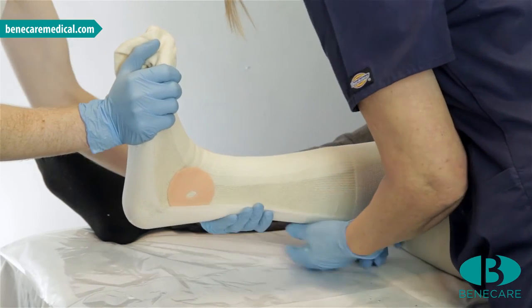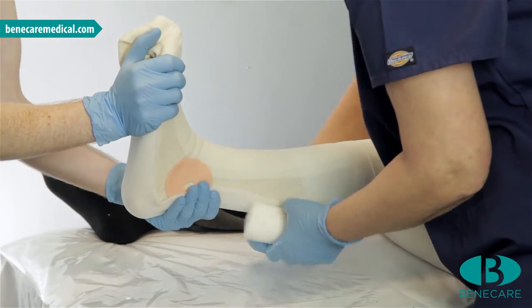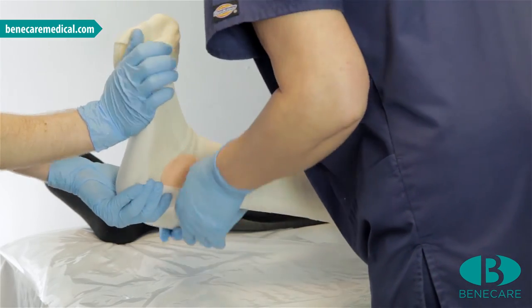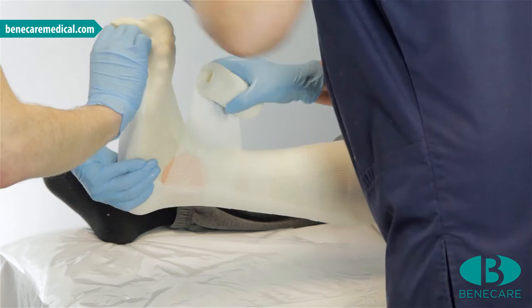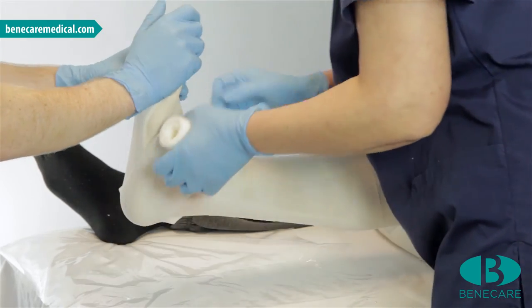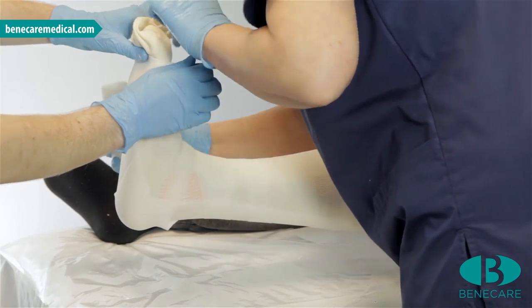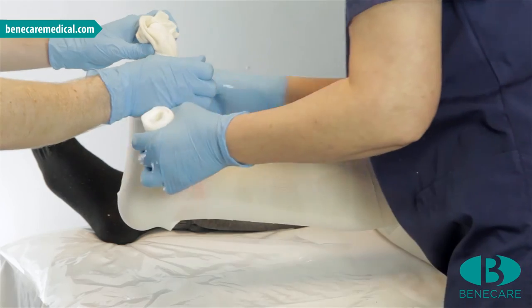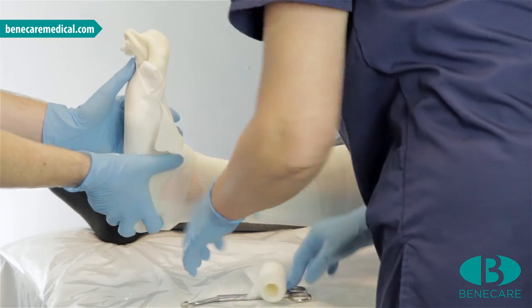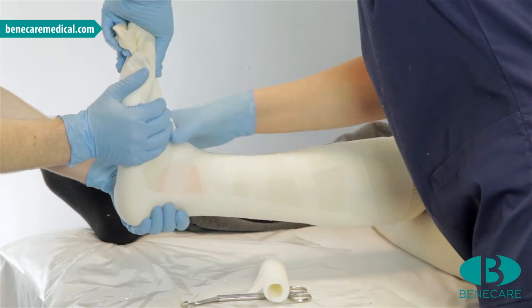Using the remainder of the roll, start at the proximal aspect and secure the slab by wrapping the roll edge to edge. Ensure the slab is a perfect fit around the ankle with no ridges. Continue along the foot to the base of the toes, and cut the material off. Mould slightly to ensure the cast is wrinkle free with excellent lamination.